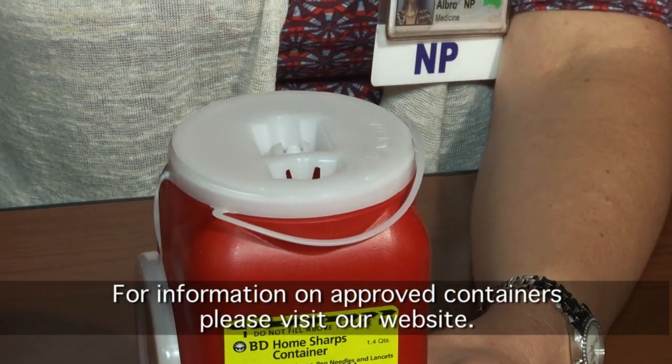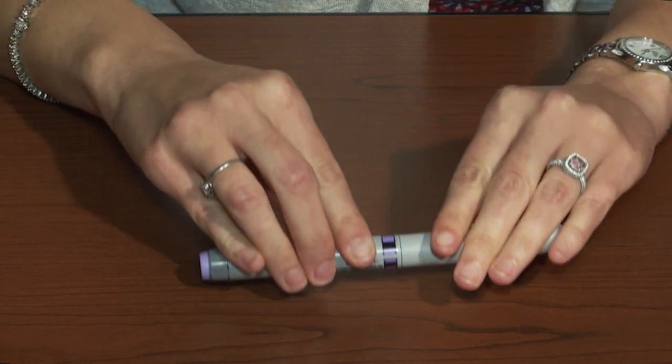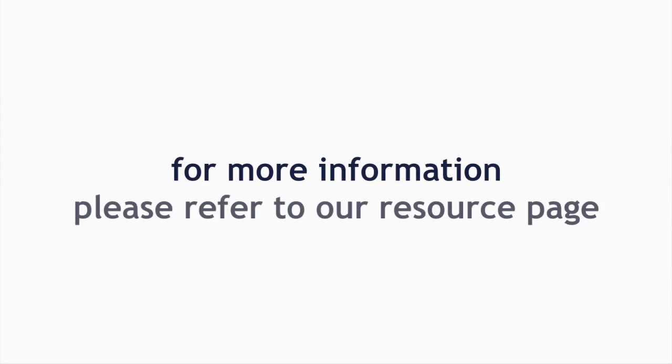Carefully replace the clear plastic pen needle cover, twist to remove the pen needle, and discard the used pen needle in an approved container. Replace the pen cap and store the pen device at room temperature for next use. For more information, please refer to our resource page.